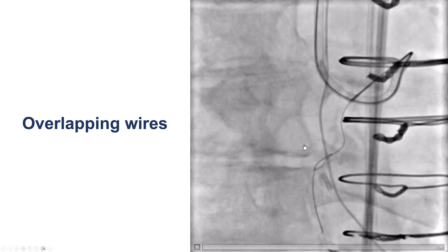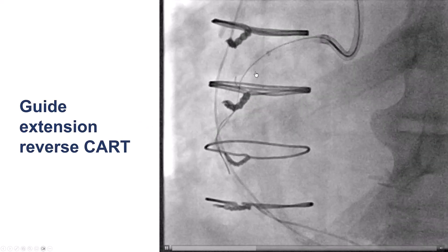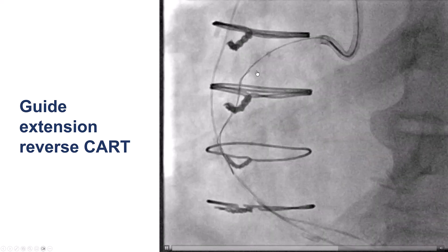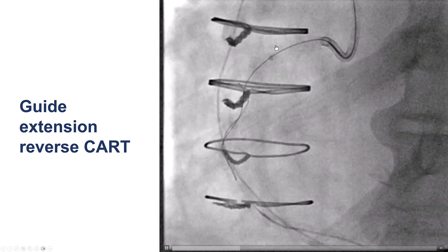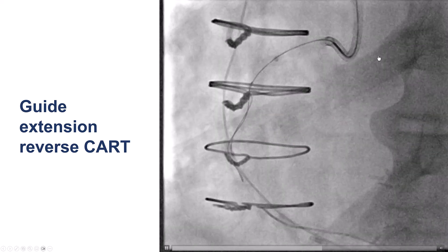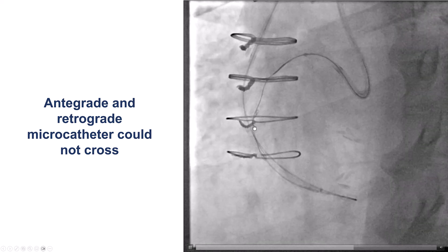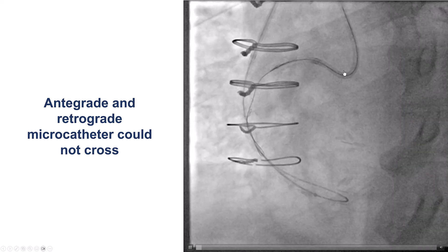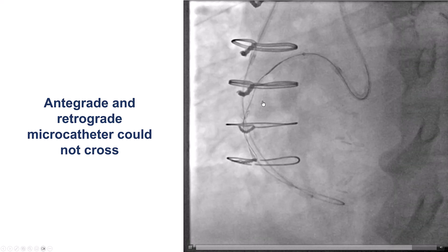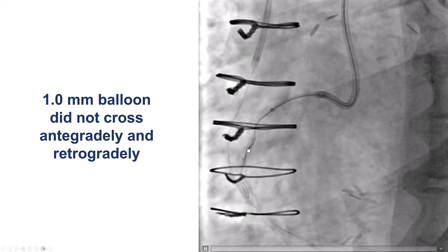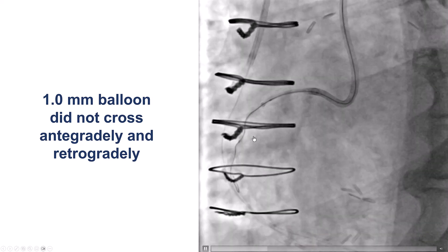We had the antegrade and retrograde wires overlapping, which is a great setup for reverse CART. We tried to advance a guide catheter extension but couldn't go very far because of severe calcification. Eventually we were able to advance the retrograde wire inside the antegrade guide extension. However, we could not cross in either the retrograde or the antegrade direction. We tried a tip-in and attempted to advance an antegrade microcatheter, and then tried a 1.0 mm balloon, but were unable to cross in either direction.